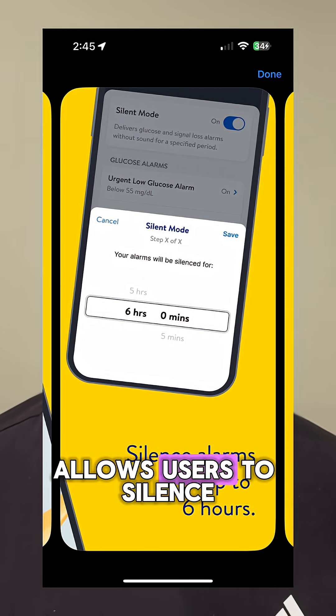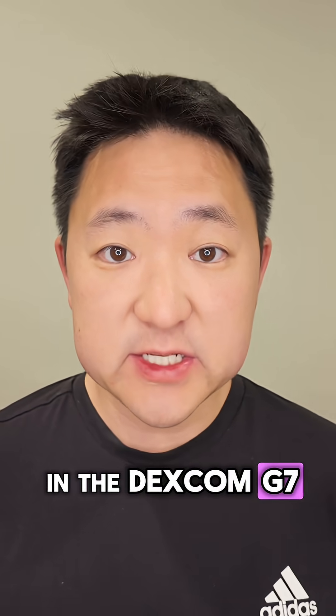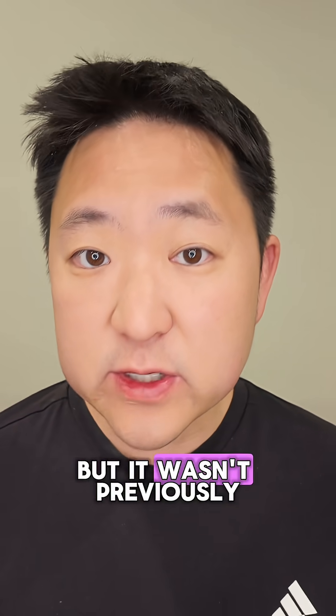Next, it finally allows users to silence all alerts and alarms for up to 6 hours. This feature is available in the Dexcom G7 app, and interestingly in the Libre 2 app, but it wasn't previously available for the Libre 3 app.